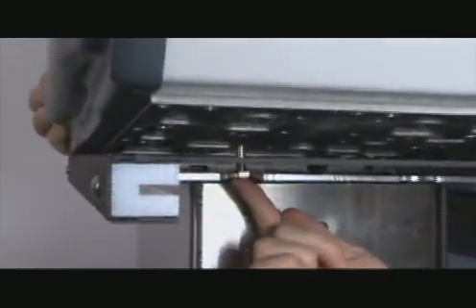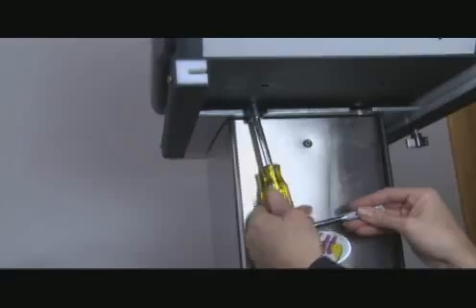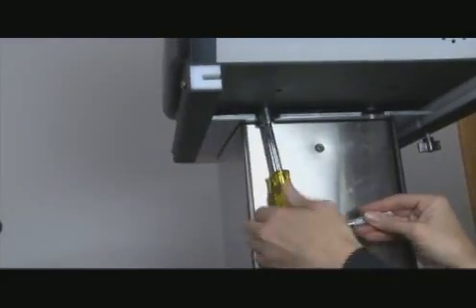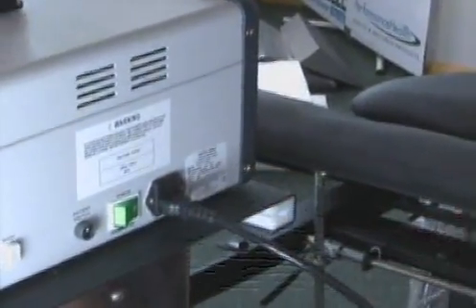Next, center the motor on the plate as shown. Tip the head up to locate the screw holes and carefully align the bolts to the holes. Use a half inch socket to tighten the bolts. After mounting the head, plug in the power cord and the patient's safety switch.